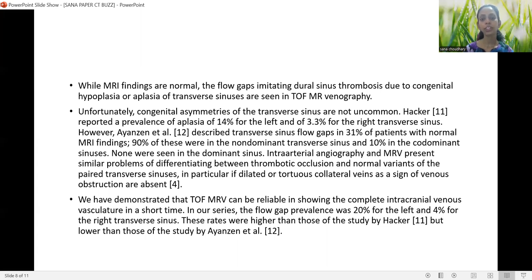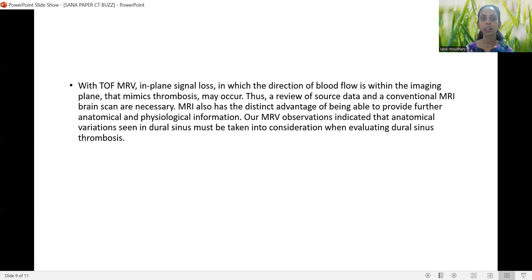We demonstrated that TOF MR venography can reliably show the complete intracranial venous vasculature in a short time. In our series, the flow gap prevalence was 20% for the left and 4% for the right transverse sinus — higher than Hacker's study but lower than Ansel et al. With TOF MR venography, in-plane signal loss — where the direction of blood flow is within the imaging plane — can mimic thrombosis. Thus, a review of source data and conventional MRI brain scans is necessary.